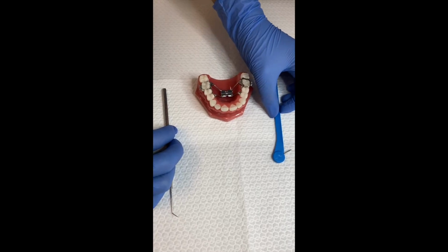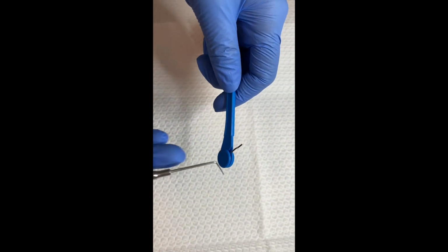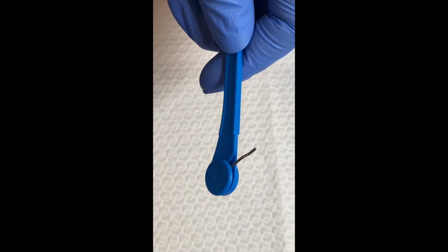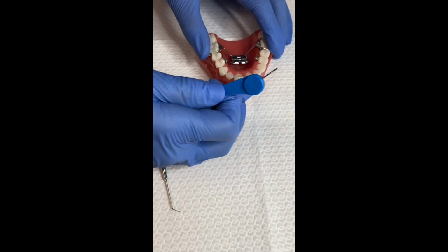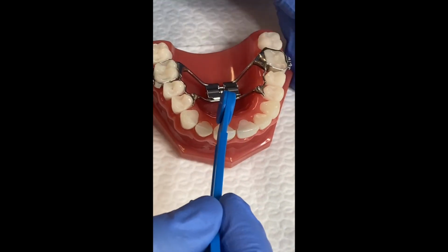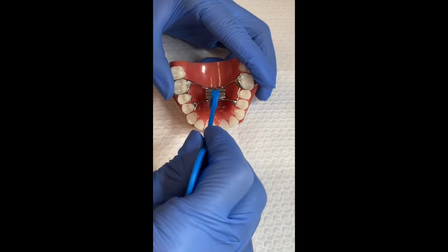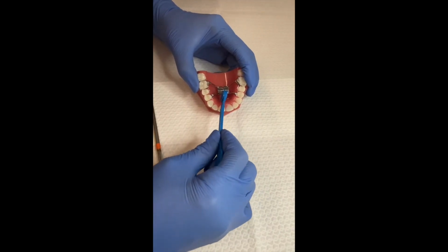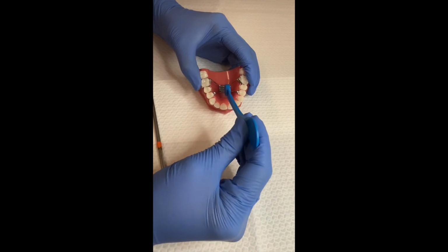The key used for the activation is designed with a safety bend, so don't worry about it reaching too far or touching the palate while you're using it. At first, find a hole towards the front of the mouth and gently insert the key into the hole until you feel it stopping at the safety bend. Then nudge the key from side to side to check it's in the hole securely and bring the handle close to the front teeth. That's how you know you're in the correct position.